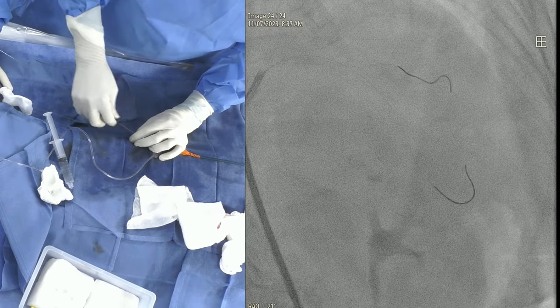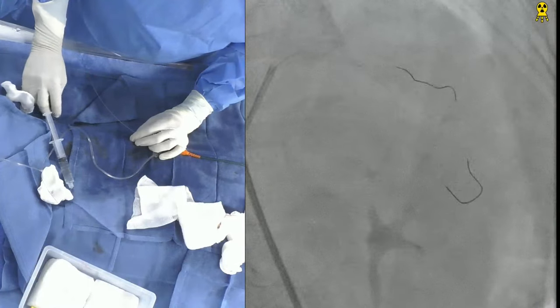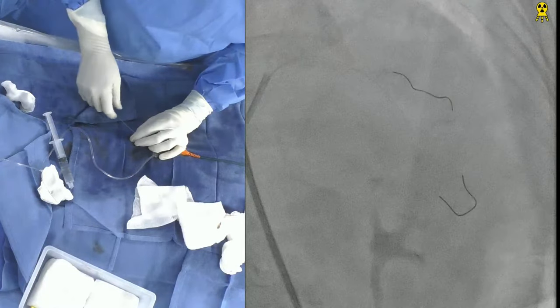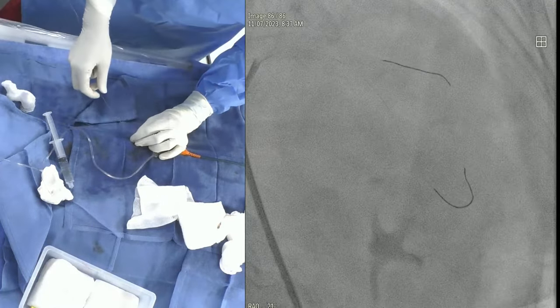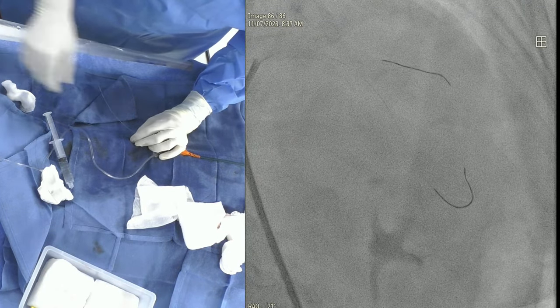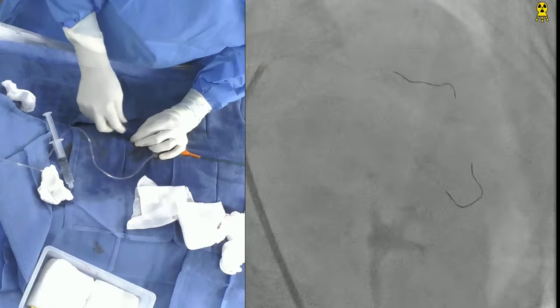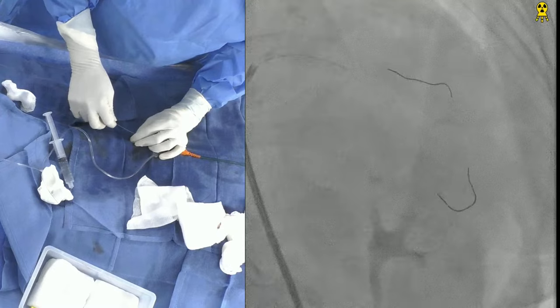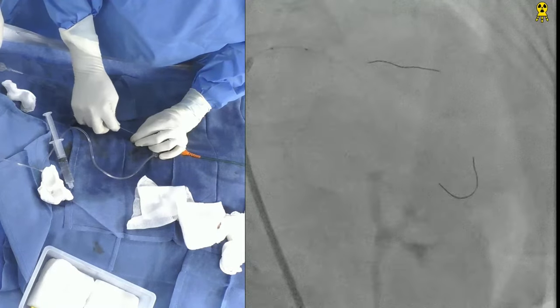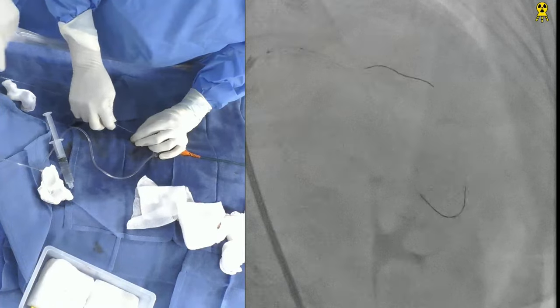And I'll cut the... No need to cut. Yeah, I'm the cut master. That's okay. So all the 300 wire, I can make it a monorail wire quickly. Go. Remove that. Get a new one?